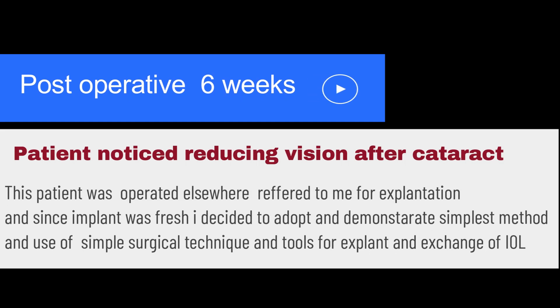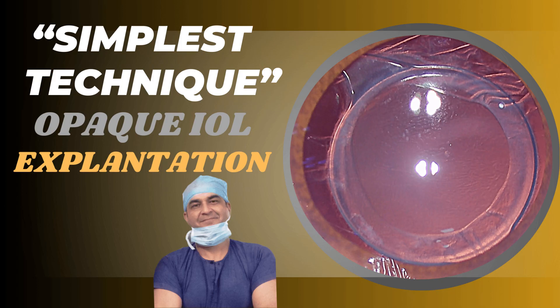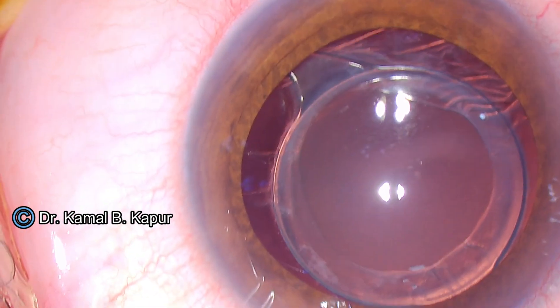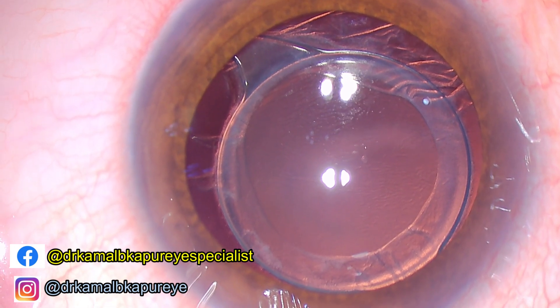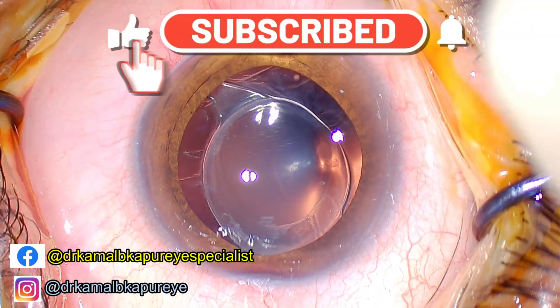This patient reported to us after six weeks of surgery and was referred to me for explantation of the IOL. When I saw that the IOL was freshly implanted, I decided to demonstrate a very simple method of explantation of such IOLs, especially a method which will be very handy for beginner surgeons who do not have access to fancy tools, IOL cutters, or other advanced surgical techniques.